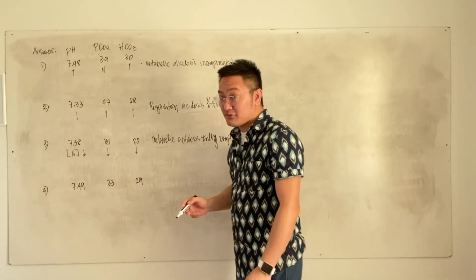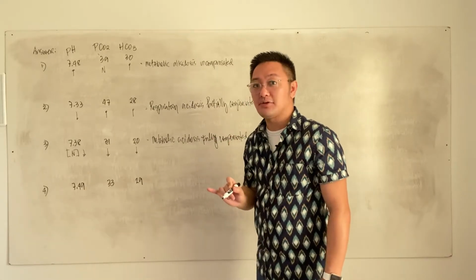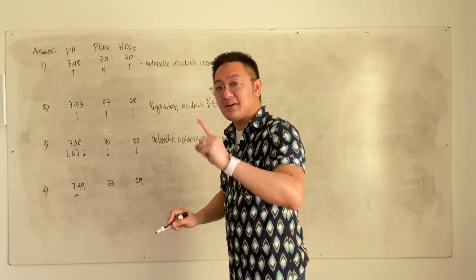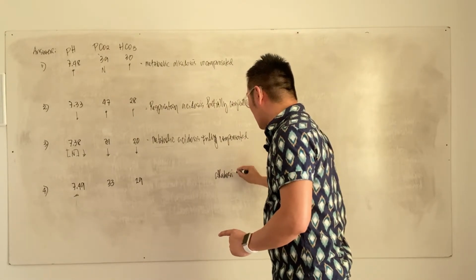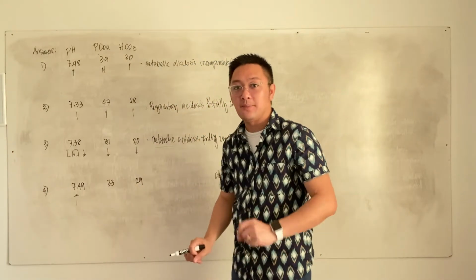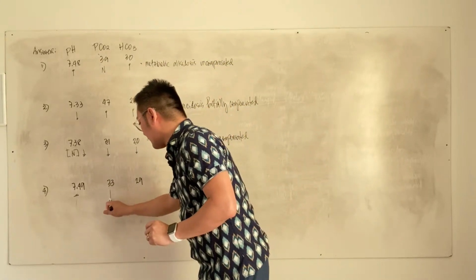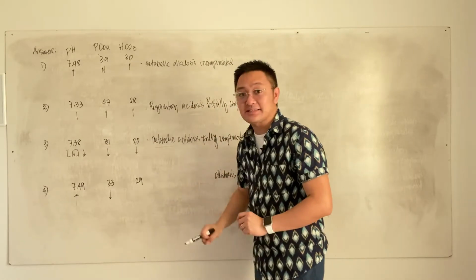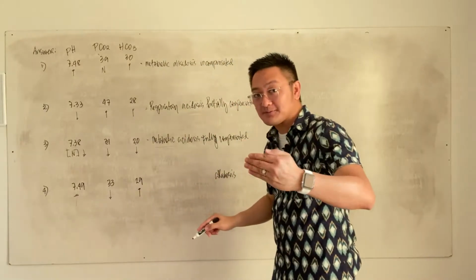Okay? Now, what about number 4? Look at your number 4. 7.35 to 7.45 is the normal pH. 7.49 is actually high. So again, if it is an increase in the pH, we call that alkalosis. Am I right? Alkalosis. Now look at your PCO2, which is 33. The normal PCO2 is 35 to 45. Here it's 33, therefore it is low. Okay? Now what about 29? Bicarbonate of 29 is high because the normal is 22 to 26. So it is high.